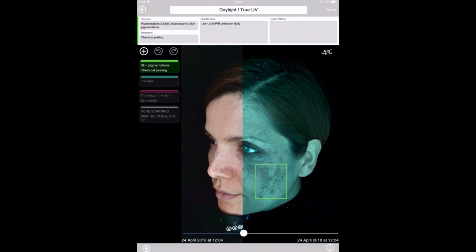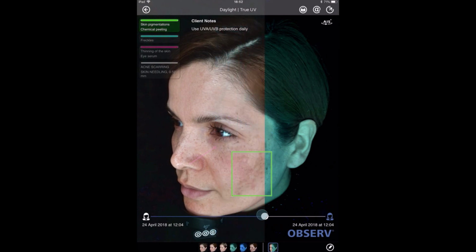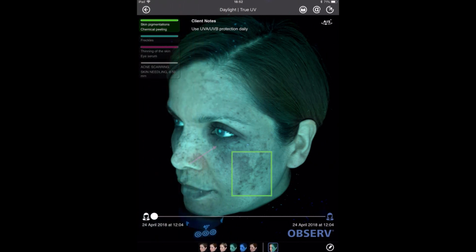Once we are done making our annotations, we will click on Done, and it will save all annotations made in a separate picture. And you see here, we can still use the slider. If you want to annotate a split screen view, first create the desired view and then go into the annotation page. Last but not least, dynamic reporting.